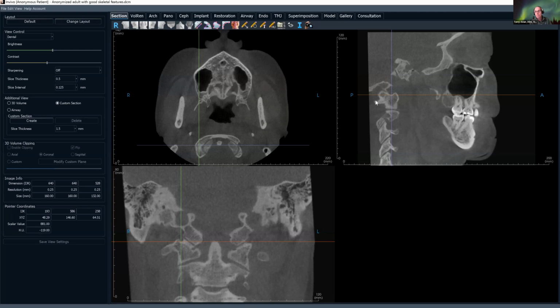And like Eagle syndrome, those are not anatomic findings. Sure, you may want to notate them, and I do, if there's particularly an enlarged ossified stylohyoid ligament, or if there's this posterior ponticle, I will definitely identify that. But those are clinical findings. The patient has to have symptoms with it. So an enlarged ossified stylohyoid ligament in and of itself does not mean Eagle syndrome. The syndrome is patient symptoms that they experience something when they turn their head.